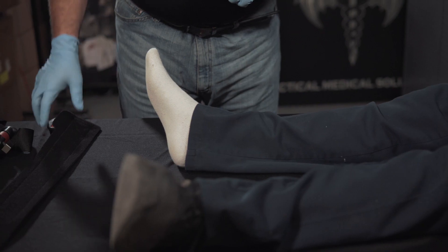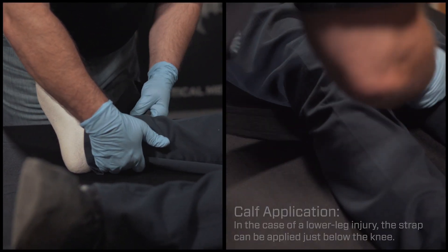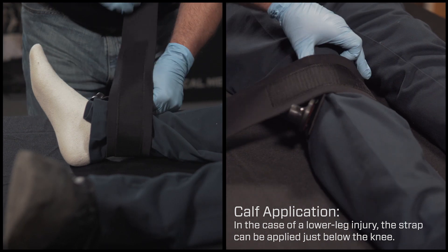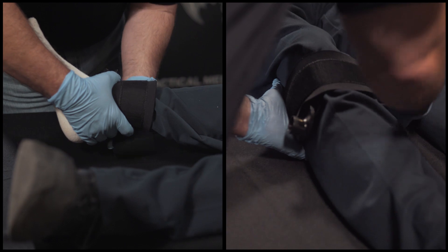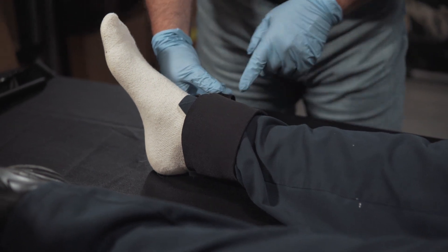We're going to start off by putting on the ankle strap first. Our patient Al is a very calm, compliant, not writhing in pain type of patient today, but you need to anticipate that this patient could be experiencing a lot of pain and not exactly wanting to sit still while you apply this. So you may need some assistance holding your patient still.